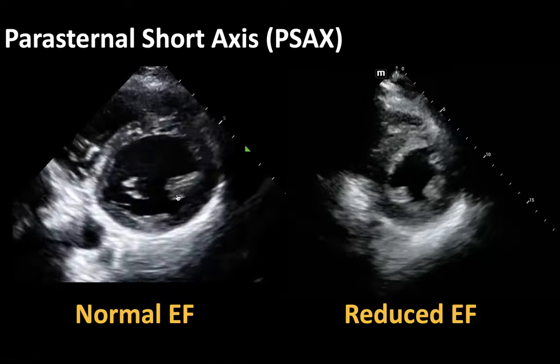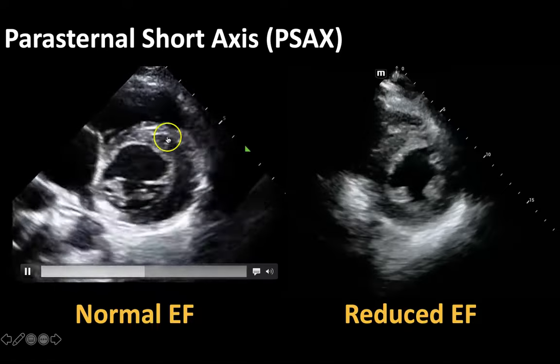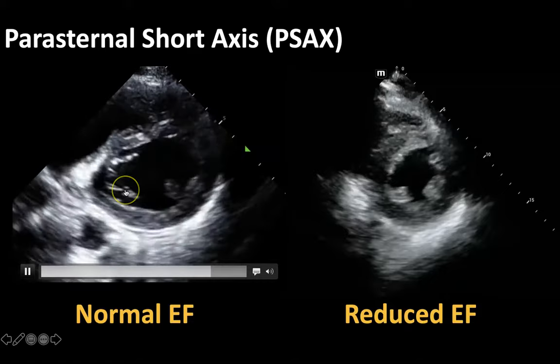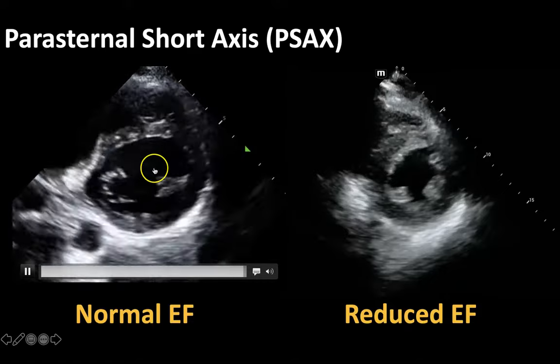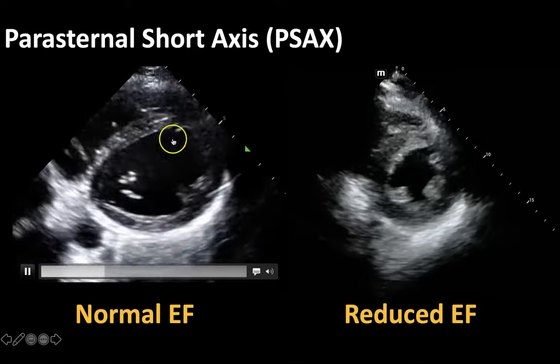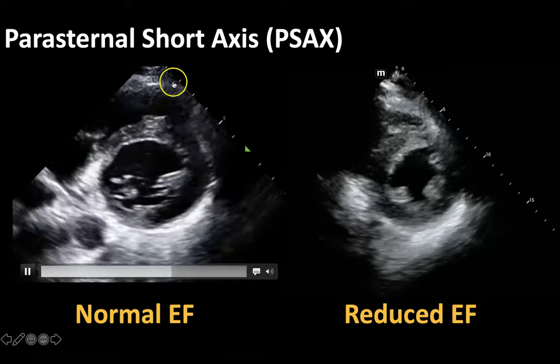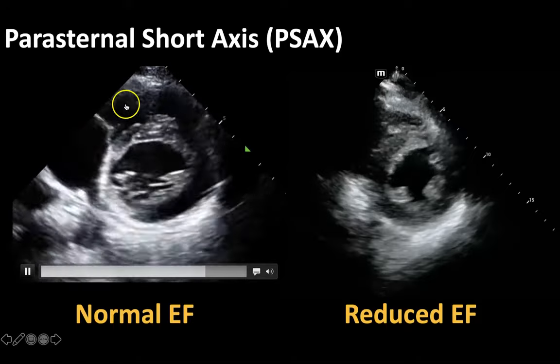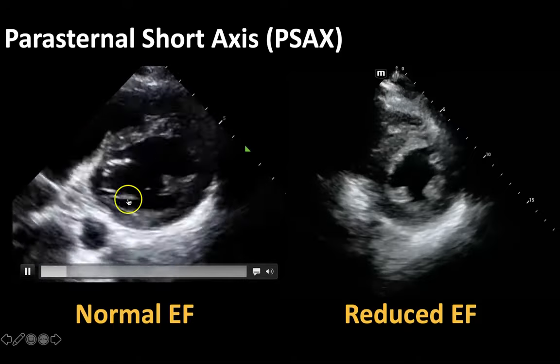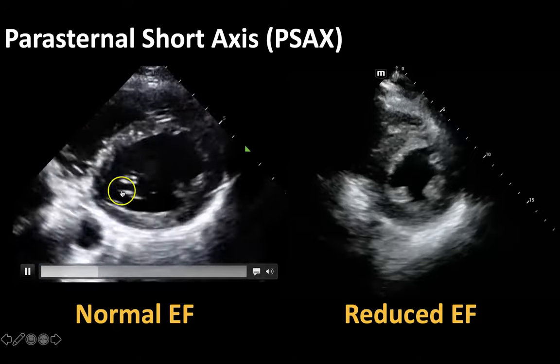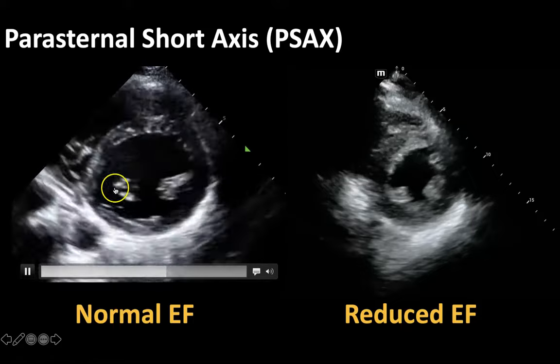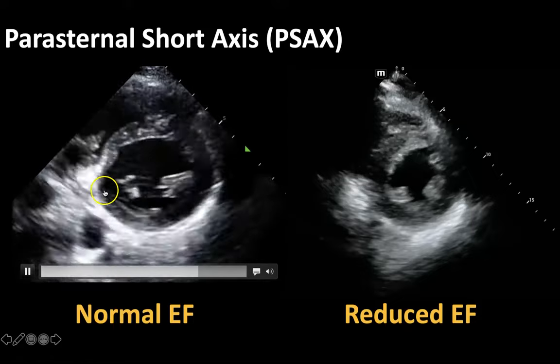So now we're cutting across the heart in a short axis. This is nice because we're seeing the left ventricle right here nice and big, and the right ventricle right here. This is at the level of the papillary muscles, which is what you're seeing here right near the mitral valve.